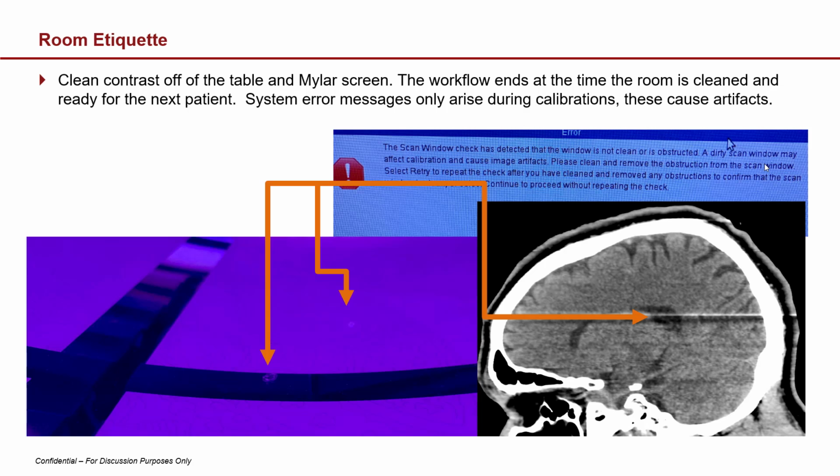And the general workflow for CT, regardless of the organization that you work for, is that you're done when the room is clean and ready to accept the next patient. This is particularly important when you're working in a hospital or in a trauma stroke code scenario where you need everything good to go, ready to go, and clean.